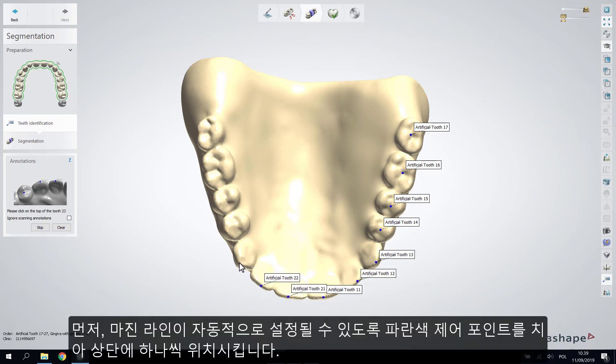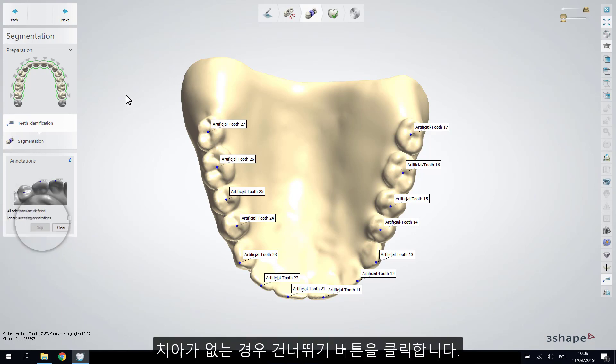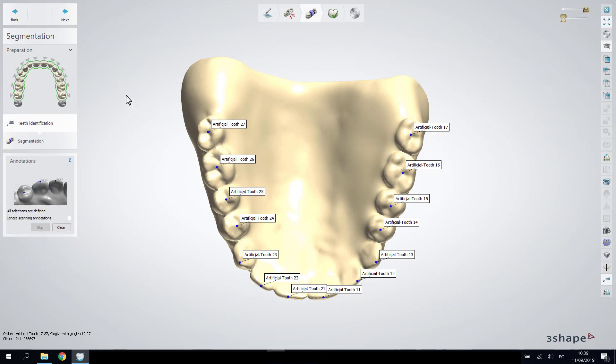The tooth identification sub-step lets you identify the teeth with annotation points. What you need to do is place a blue control point on top of each tooth one by one for the line to be set automatically. Choose the Skip button if the tooth is missing.